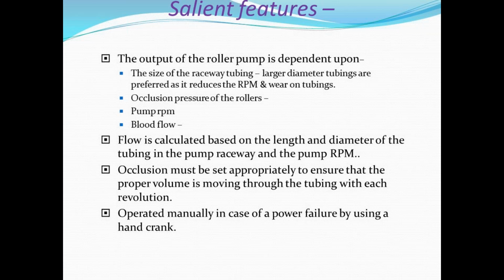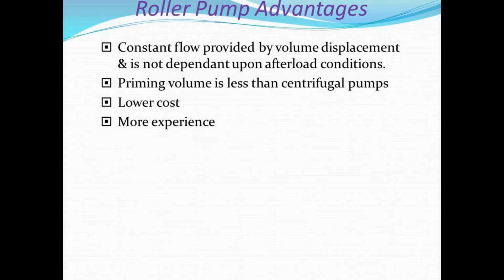The advantage of this is it is a constant flow, independent of your preload and afterload. Priming volume is less as compared to centrifugal pumps, and it is lower cost. People in the cardiothoracic department have got more experience with the roller pump than the centrifugal pump.